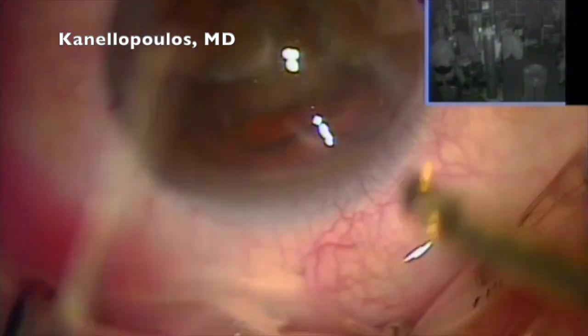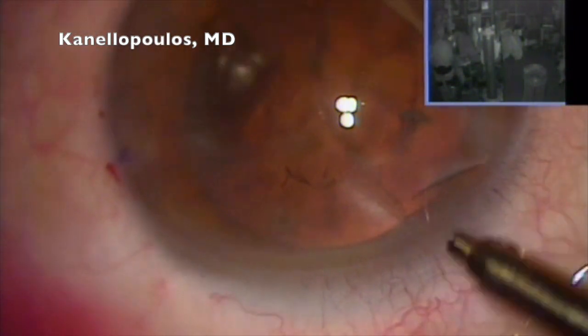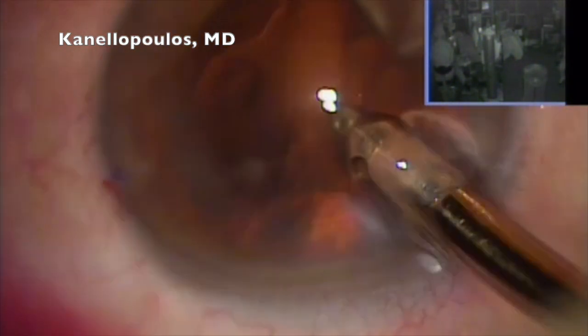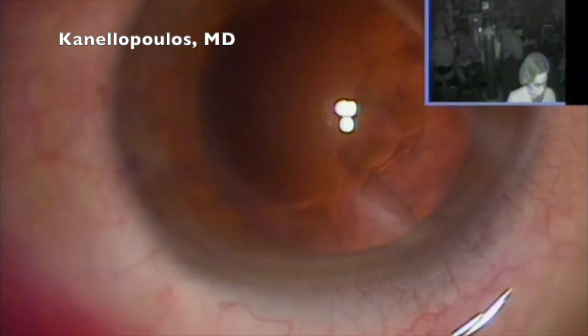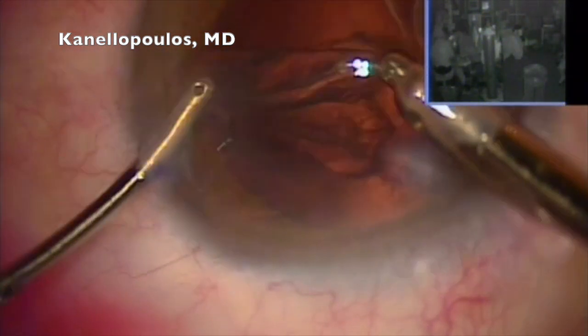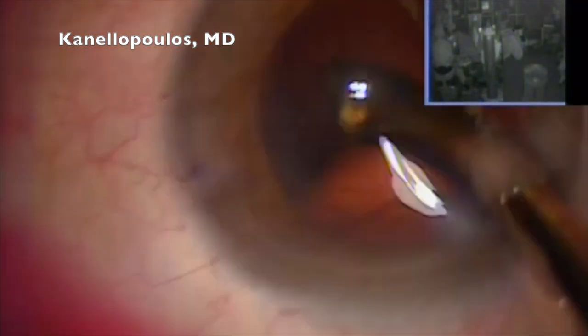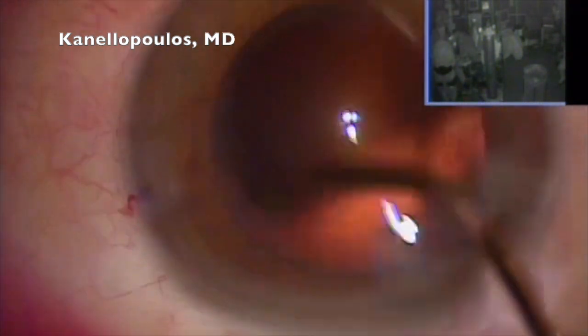I promise you I'm not as fast as it looks on this video, but I do keep good time. More importantly, our number one priority is safety. I operate on patients in Greece with peribulbar anesthesia so I can have that enhanced tolerance. I'm using my left hand to remove the cortex under my main incision. Fill the bag with methylcellulose, coming in — polish the posterior capsule.